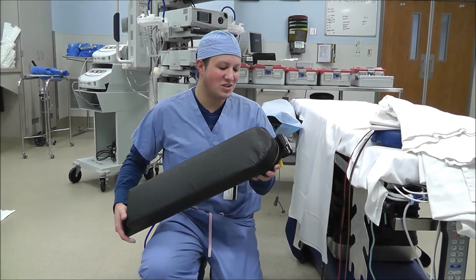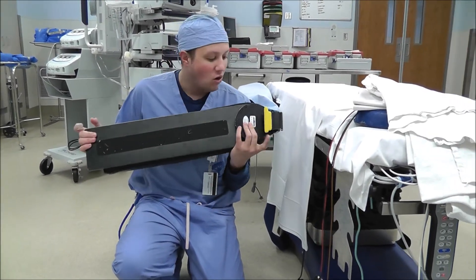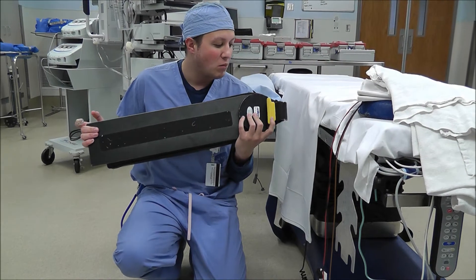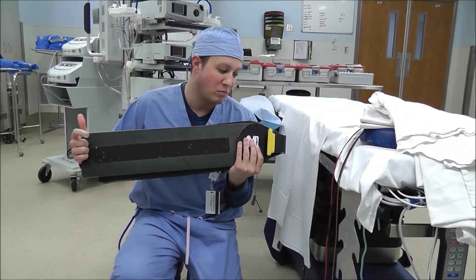This here is an arm board. So basically you want to look at it and see where your levers are at. This one only has one lever down here. Most of the arm boards at this hospital have another lever down here to help you move it.